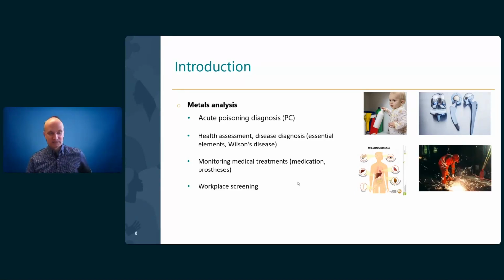Also, we perform analysis for metals in a workplace screening scenario. So we know workers could be highly exposed to different contaminants, including metals. So for some companies, we are doing a kind of regular checkup to make sure that those workers are not too exposed, and so they don't need to get retired from the field.